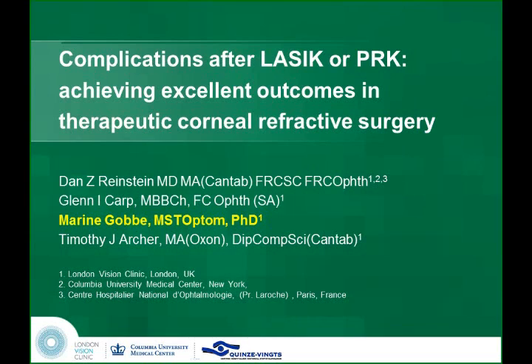You mentioned that the population had more improvements with the aberration in the wavefront-guided. But isn't this going to be a two-stage correction, because you're first going to... No. Okay, so the question is, topography-guided, we have said, removes less tissue than wavefront-guided. The question is, isn't it going to be two-stage anyway, the topography-guided followed by refractive, and then the sum total is the same as if you'd just done a wavefront? I think that's your question.